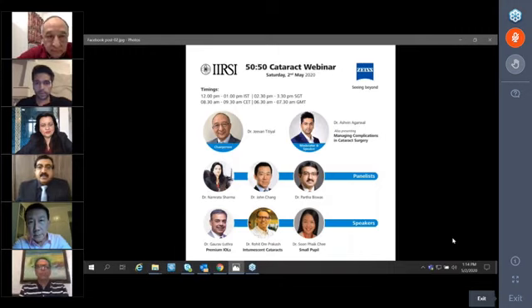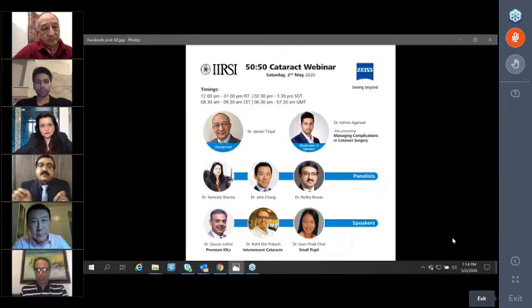Ashwin, this was absolutely level 3 of difficulty in situation, because not only was there a PMMA, but it was a fibrosed capsule, and also you had the CTR in place. So removing the bag with the CTR and the PMMA lens would have been the easiest way out. Of course, you have handled it extremely well because of the expertise you have for handling these cases. But again, if one is conservative, one takes out that whole bag, CTR and lens complex, and then goes in with a fixation of a 3-piece lens, and that is a glued IOL. So that is how I would also have handled it.